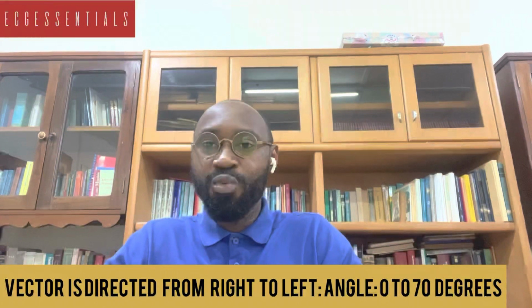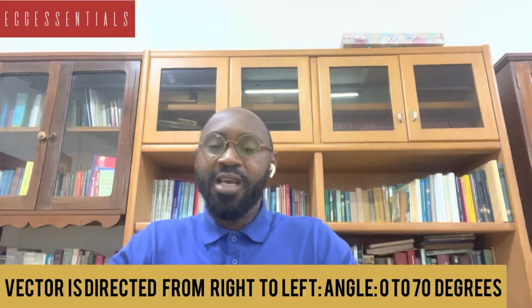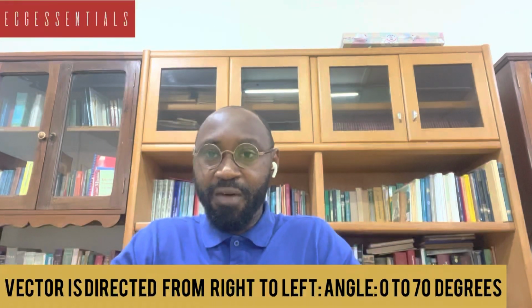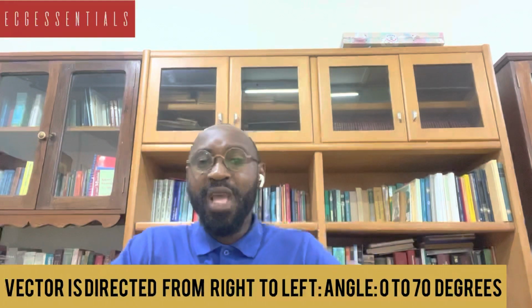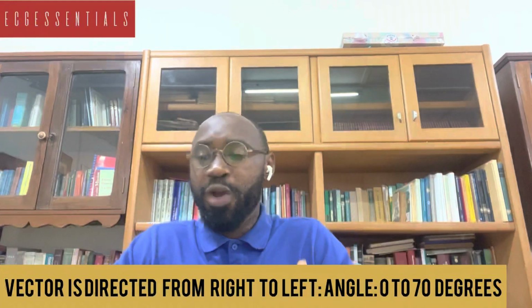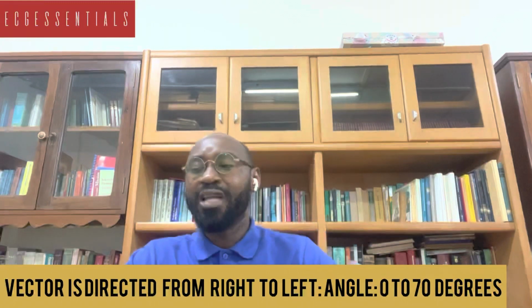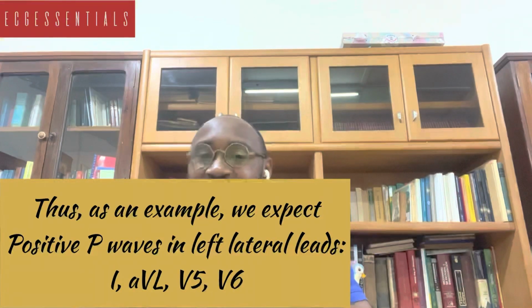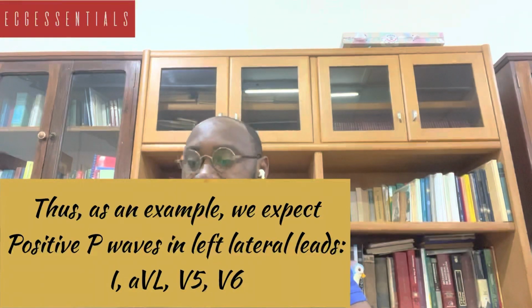The angle of the P wave overall vector is between 0 and 70 degrees. What it means is that any lead that views the wave of atrial depolarization as moving toward it will record a positive deflection. Any positive electrode that has this overall vector of depolarization of the atria moving towards it will record a positive deflection for that P wave.